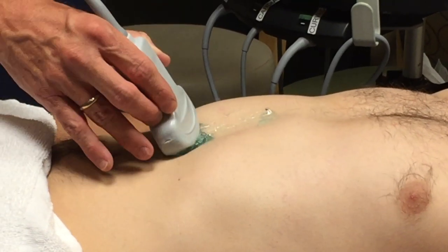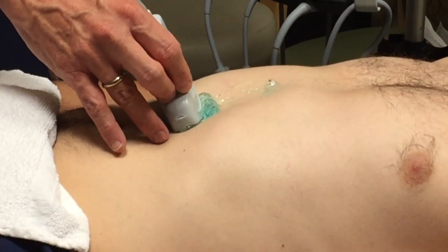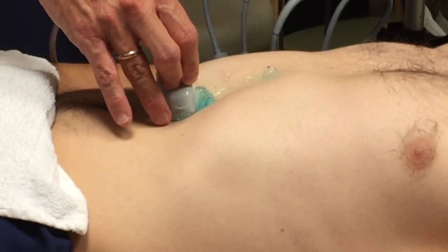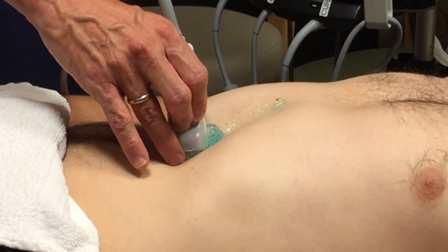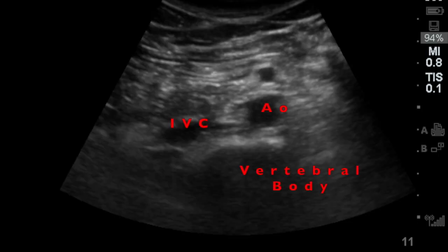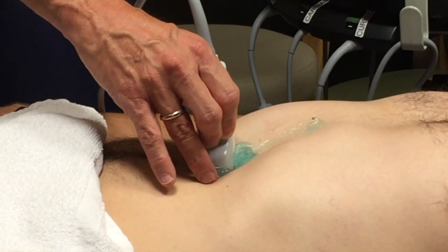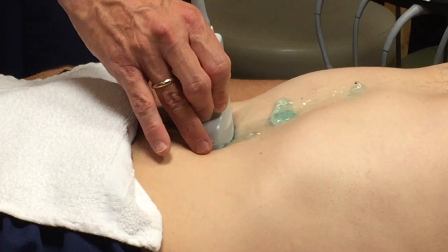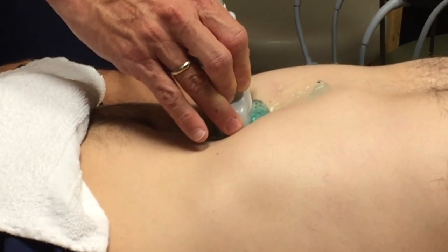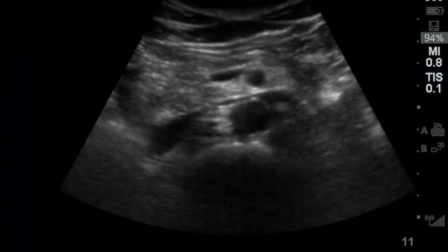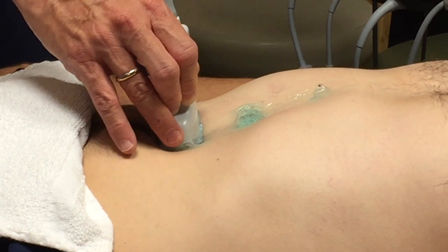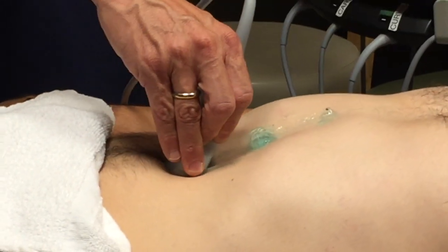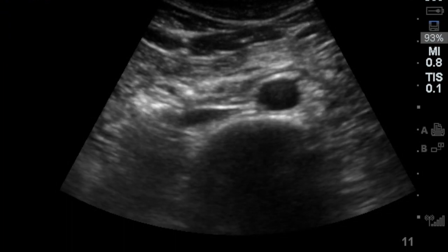For the aorta, I use the curvilinear probe with the marker pointed to the patient's right, center of the abdomen, pushing with gentle steady pressure to get the bowels out of the way. I'll see the vertebral body, the IVC, and the aorta. Once I find the aorta, I slide the probe down and up the abdomen, trying to get as high up as possible. Once I get down to the umbilicus, I can tilt the probe down and see the bifurcation of the aorta.